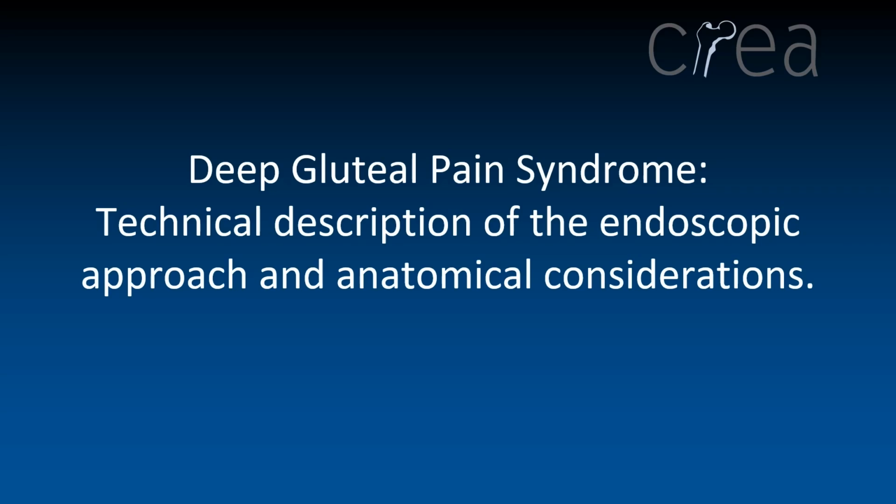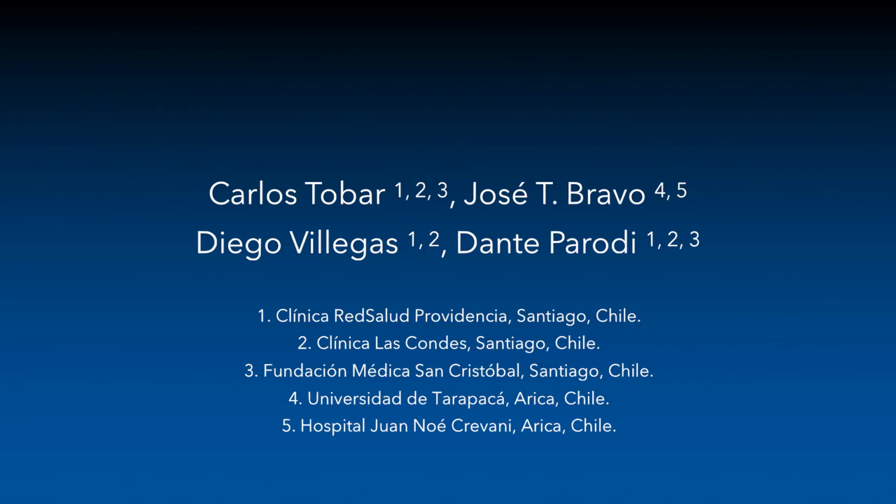Deep gluteal pain syndrome, technical description of the endoscopic approach and anatomical considerations. The purpose of this study is to present an original surgical technique for the treatment of deep gluteal pain syndrome that allows access to both the peritrochanteric and subgluteal spaces through modified endoscopic portals.